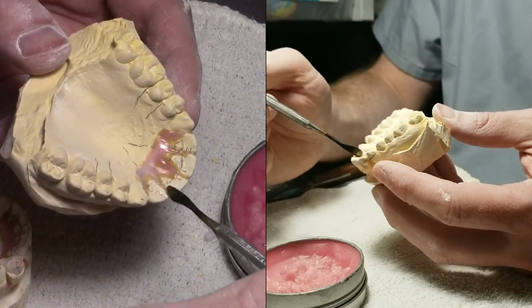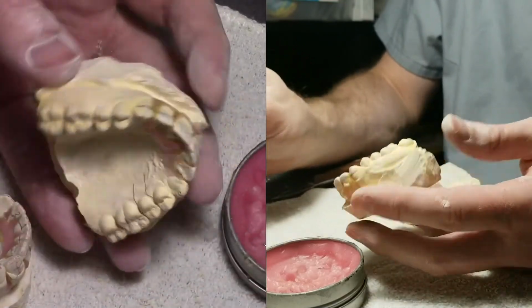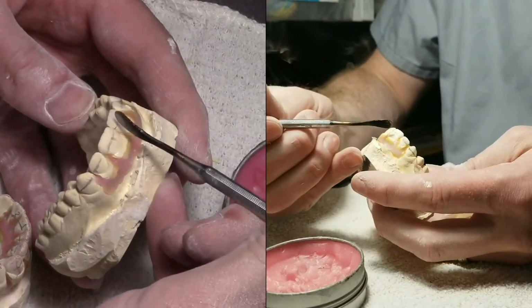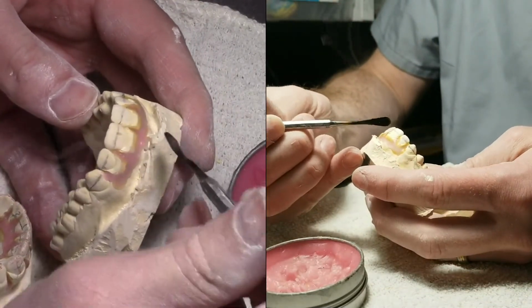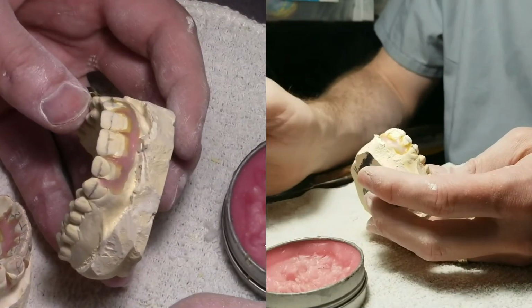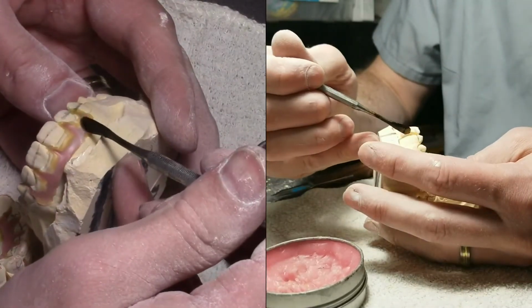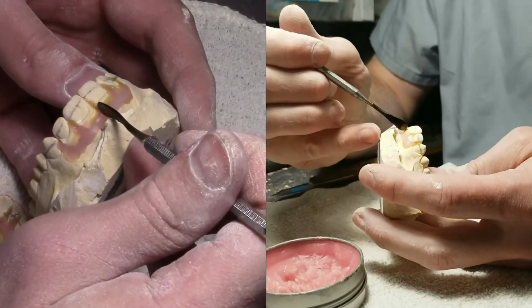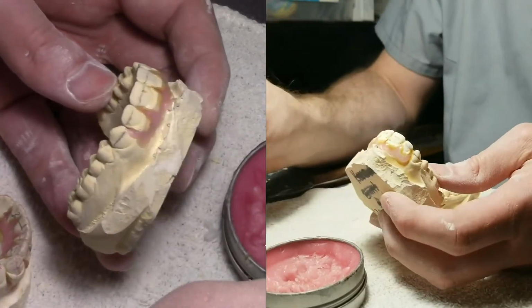This method is a good method for when the doctor says no stripping. That way, I don't cut between the teeth. I just actually break between the teeth. Let them just break naturally at their natural break point where I've actually scored it, which is right between the teeth.